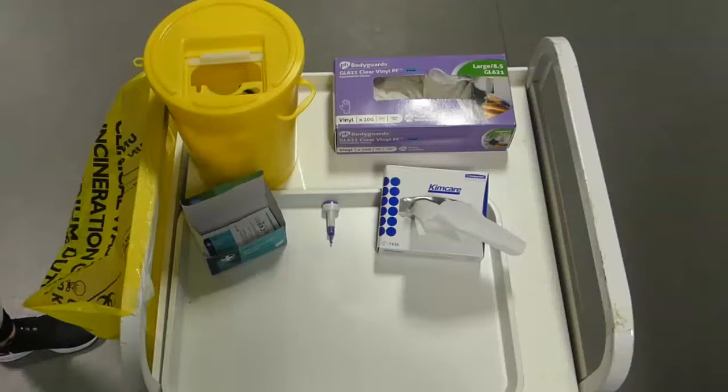Here on this tray you can see all the equipment needed. There's alcohol wipes, a safety lancet, tissues, additional gloves and appropriate clinical waste including a sharps bin for sharp waste and a clinical waste bag for all additional clinical waste.